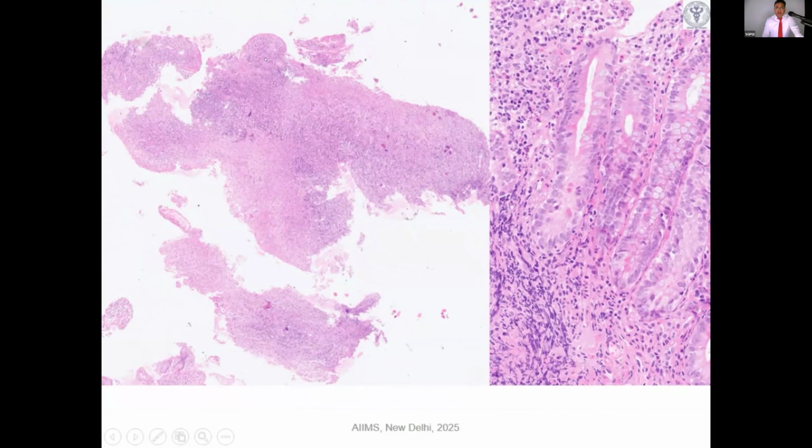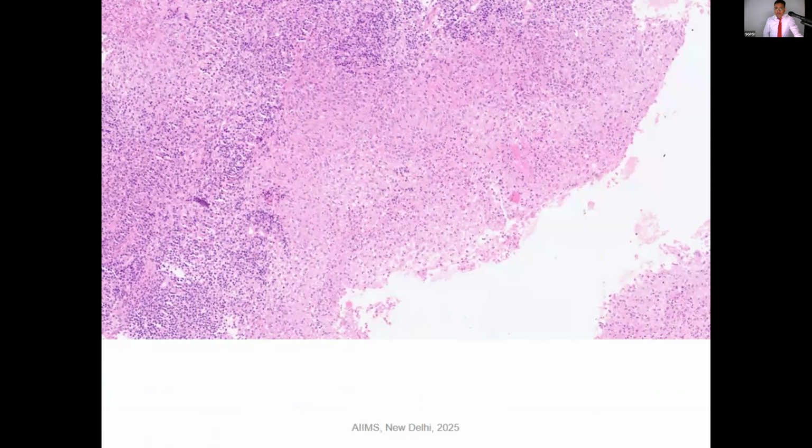And here the other fragment, which is ulcerated, this area is pale, we'll see later. And look at the crypts in the preserved areas. What you are seeing here is a kind of metaplasia. So what is this metaplasia? Pyloric metaplasia, that is also a feature of chronicity other than the architectural distortion. So this is chronic active ileitis, and that is possibly patchy.